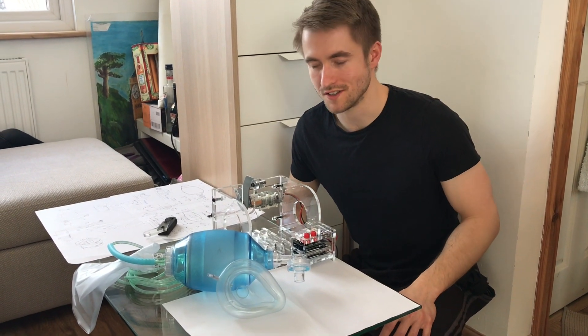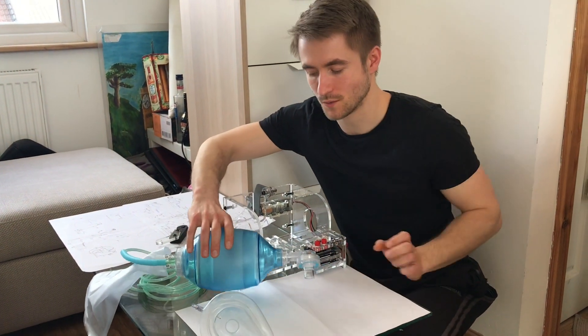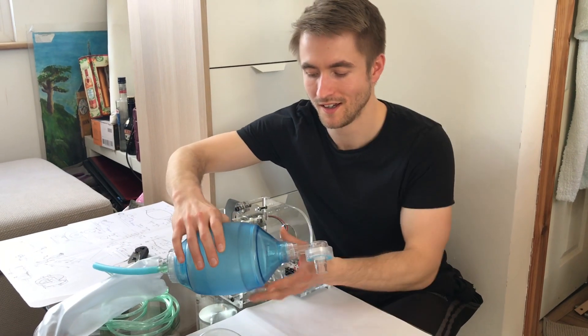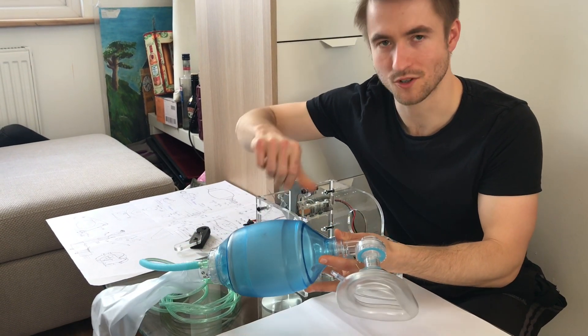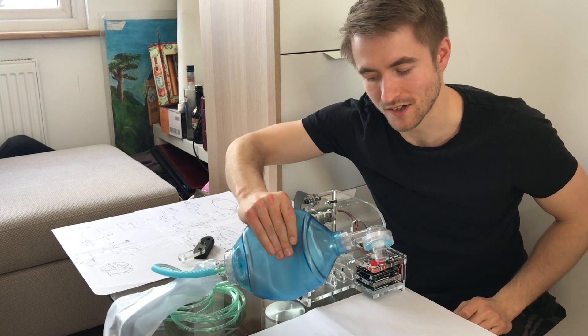Hi everyone, this is my design for an open-source ventilator for COVID-19 treatment. It's based on a bag valve mask — also called a BVM or an ambu bag. These devices are designed to be clipped with a mask and pumped by hand, so what I'm going to do in my rig here is effectively replace the hands so that it's squeezing the bag for you.